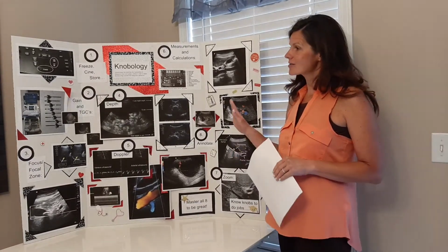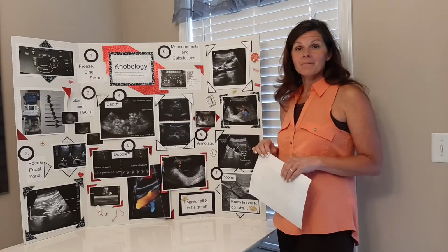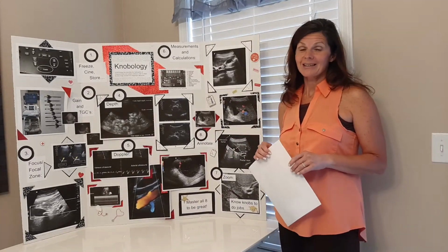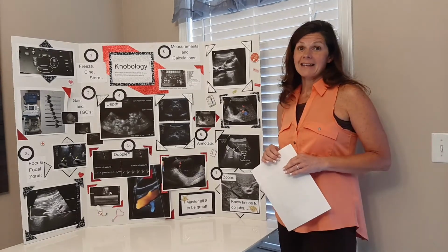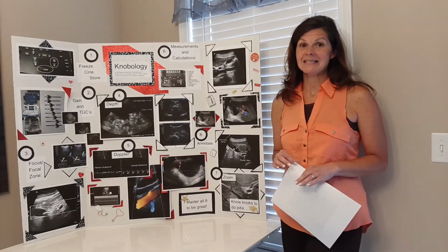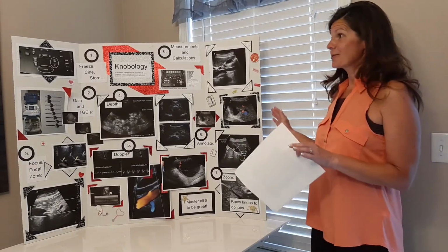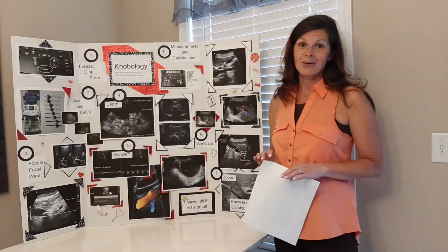If you master these 8 simple knobology functions, you'll be able to produce high quality diagnostic images on any piece of ultrasound equipment that you sit down at. In a nutshell, if you know these knobs, you'll be able to do any job that you need to do.